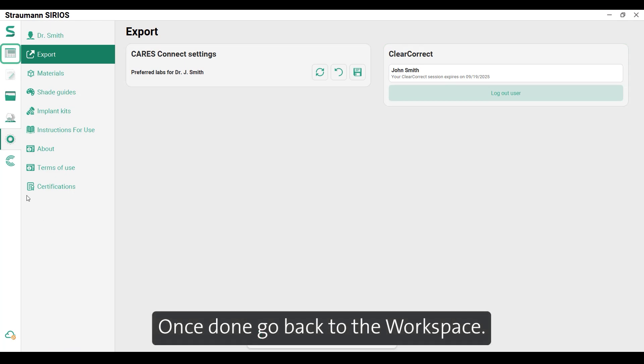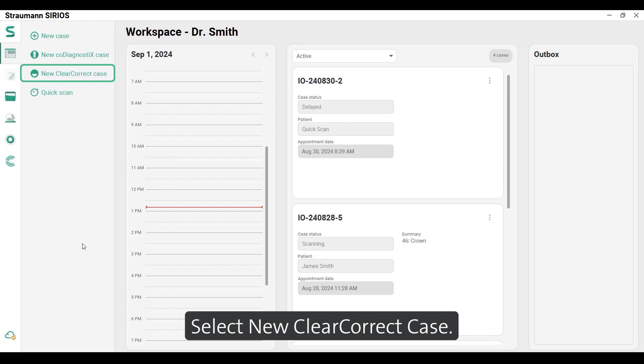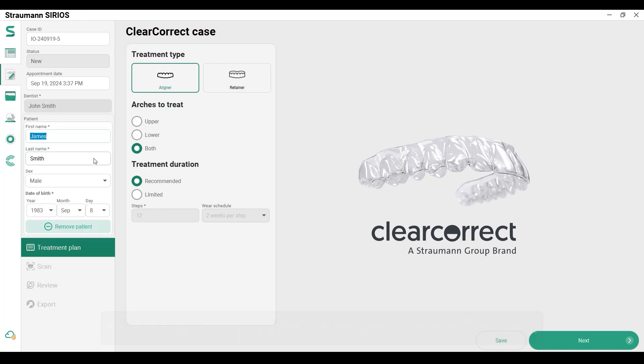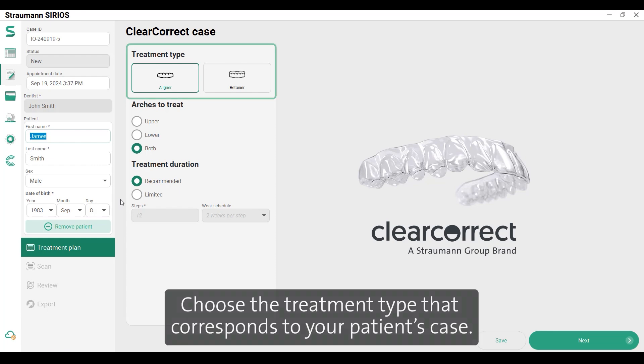Once done, go back to the workspace and select New ClearCorrect case. Add your patient information. Each field is mandatory in order to move forward.